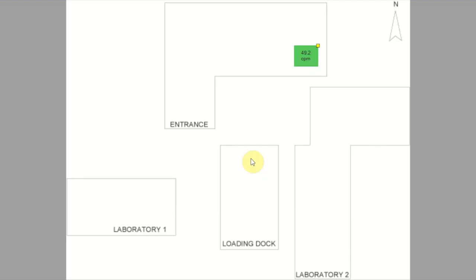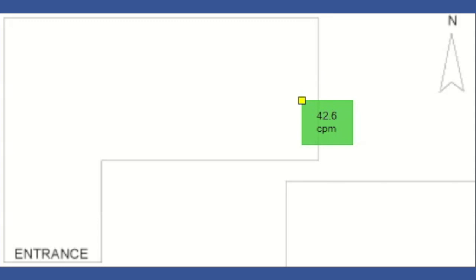Another exciting innovation, the user can now upload a floor plan schematic and place icons representing each area monitor in the network, thus providing a live graphic display of each unit location.